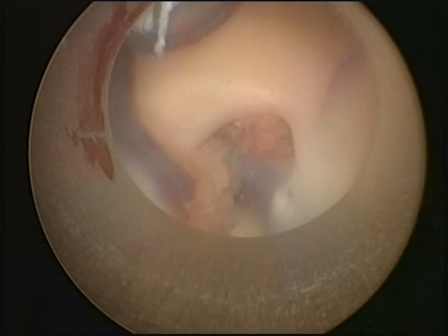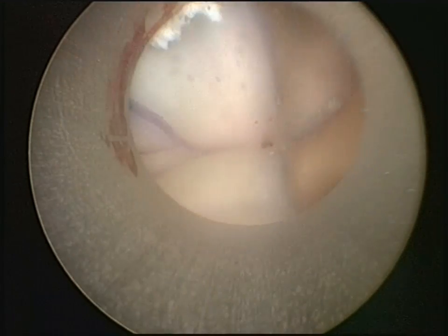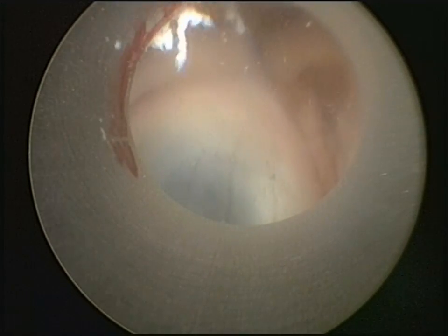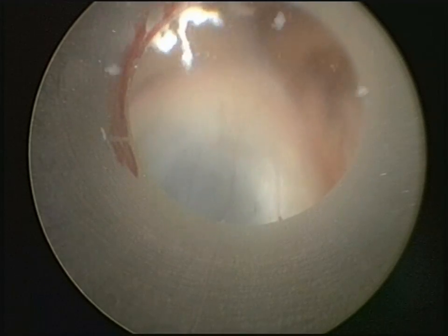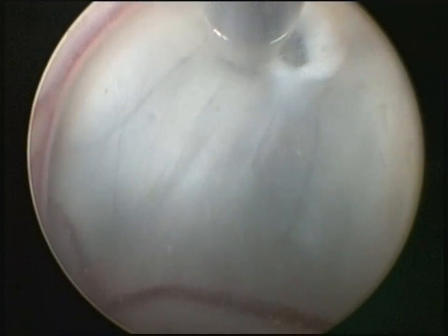The endoscopic inspection of the right lateral ventricle shows a nearly closed foramen of Monroe as well as a clearly bulging septum pellucidum. In the dorsal area, the septum is very thin and almost transparent. The septum is circularly coagulated.